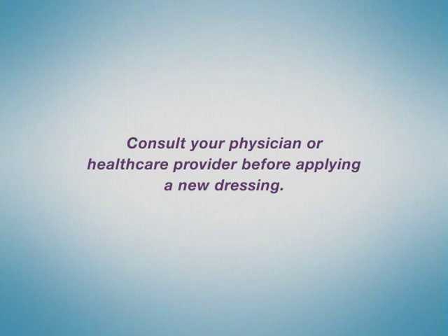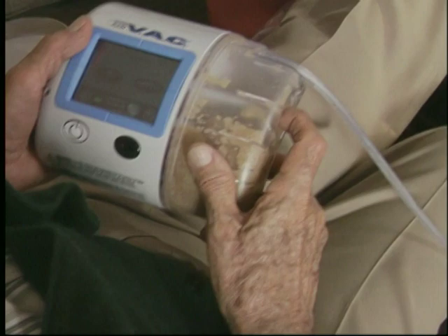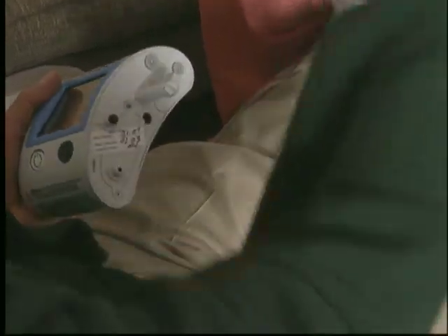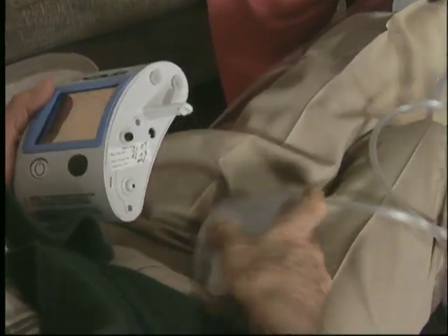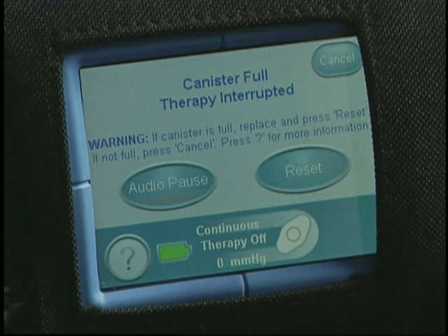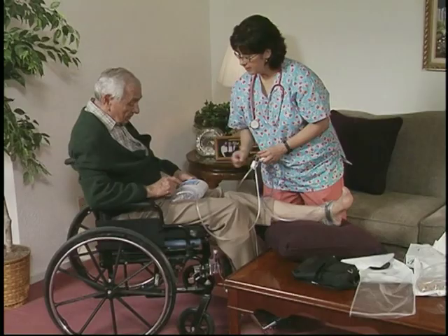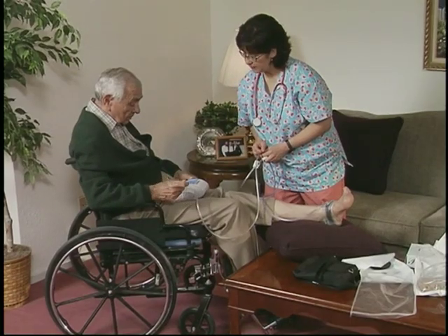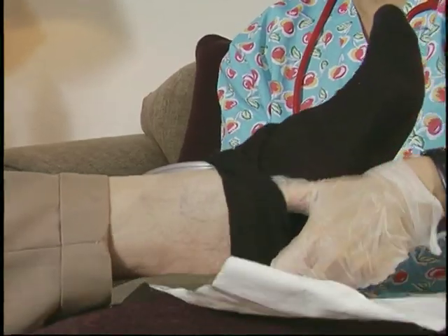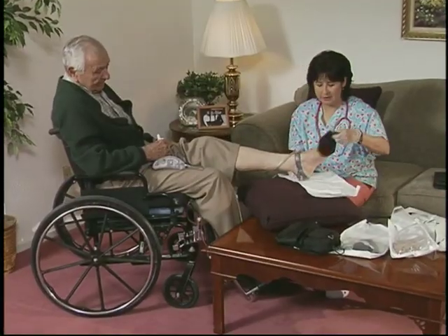When the canister fills with fluids collected from the wound, it can be easily removed. You may or may not need to change the canister on your unit every two days. An alarm will alert you when it is full. Simply remove it and snap a new one in place. This should be done at least once a week. Your health care provider will tell you how to dispose of it properly. Your health care provider should evaluate the fluid removed from the wound.